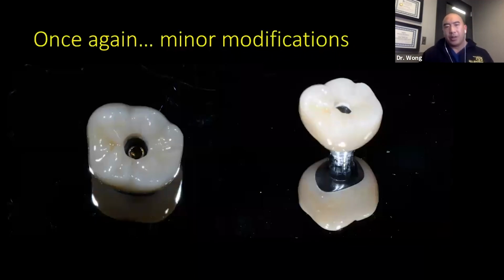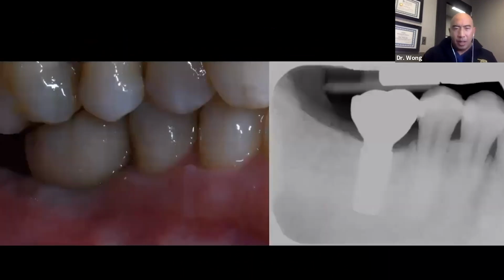So once again, very, very minor modifications. You can see that it's not the implant position. The implant position puts us right in the middle of the central fossa. So I'm pretty happy with the implant position. It's all about the soft tissue here. So what we do is we get a wider healing abutment. We don't always have to do everything customized, but in this situation, we just put a fatter healing abutment on for the patient. And then here we go, new crown.